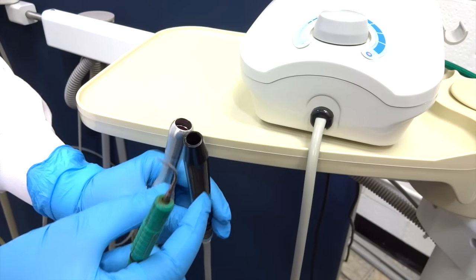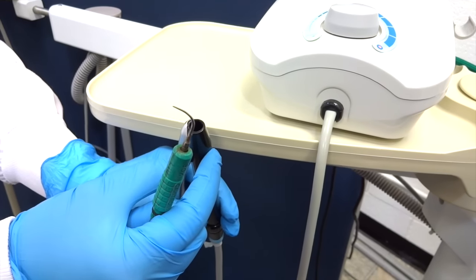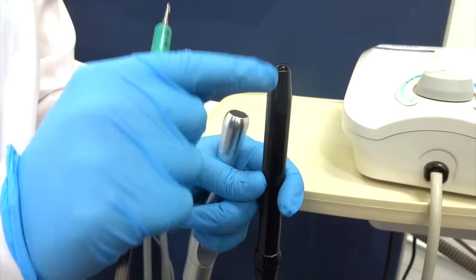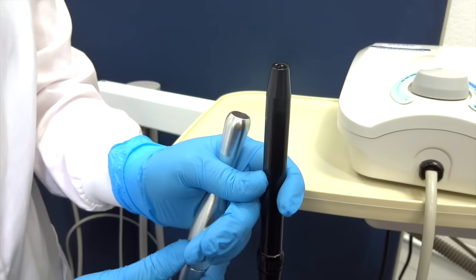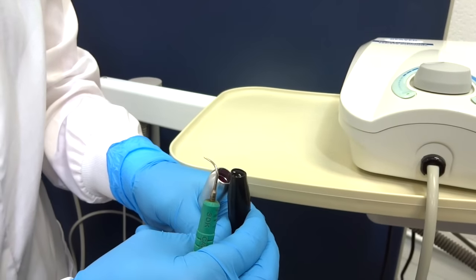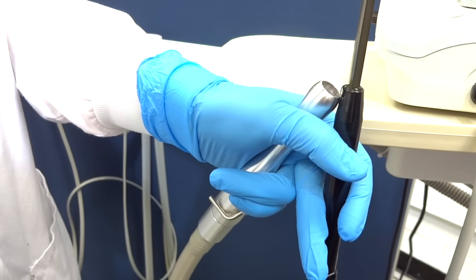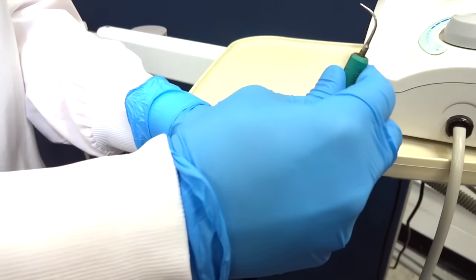I'm pushing my button on the floor to fill the ultrasonic hand unit up. You get a nice little bubble on the top. I like to turn on my high speed evacuator when I place the ultrasonic tip in the handle to catch the extra water, so I'm not making a huge mess.